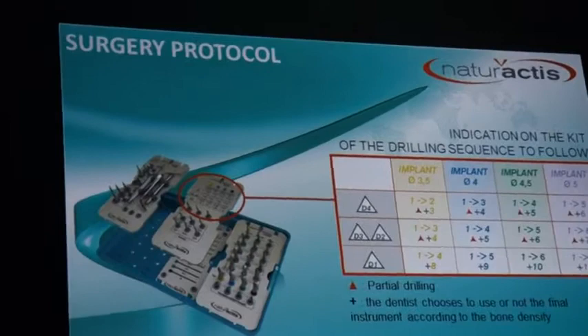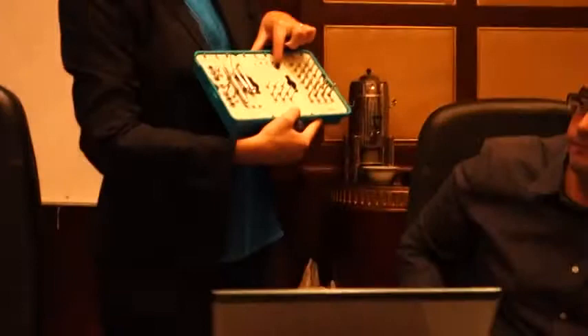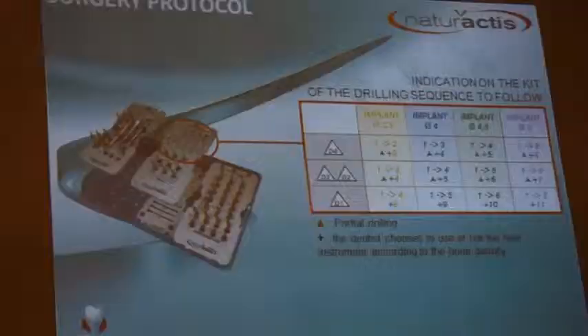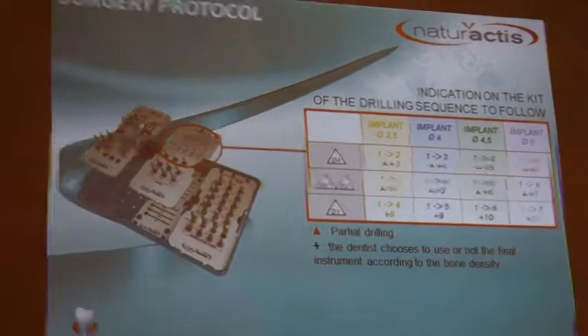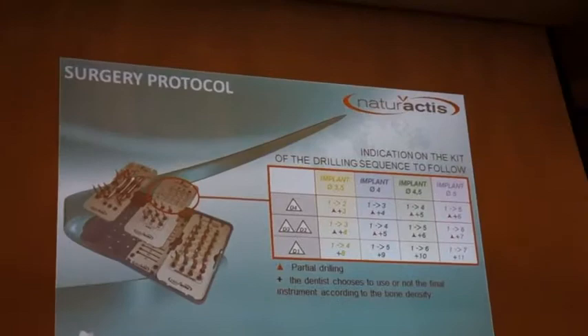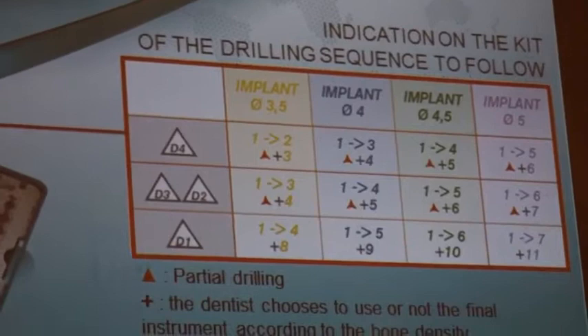You can look on the kit for the protocol indication. For example, today during the workshop we are placing implants of diameter 4mm, length 10. This jaw represents medium bone density — D2, D3. The protocol to follow goes from step 1 to step 4. The optional step 5 means you pass drill number 5 according to how you feel the bone: if it's harder, pass it; if softer, skip it.